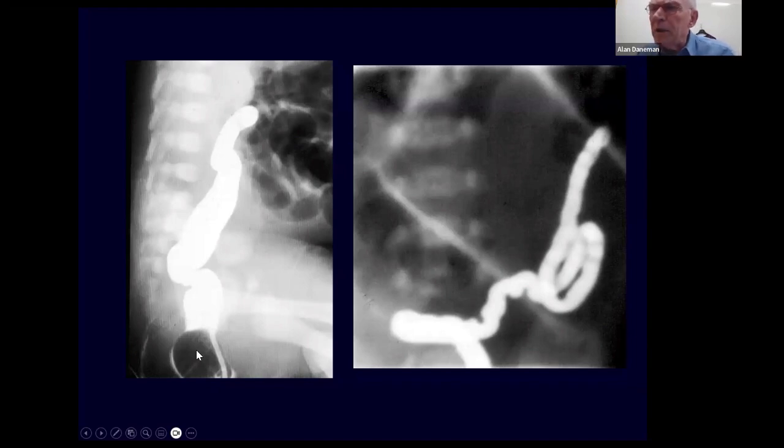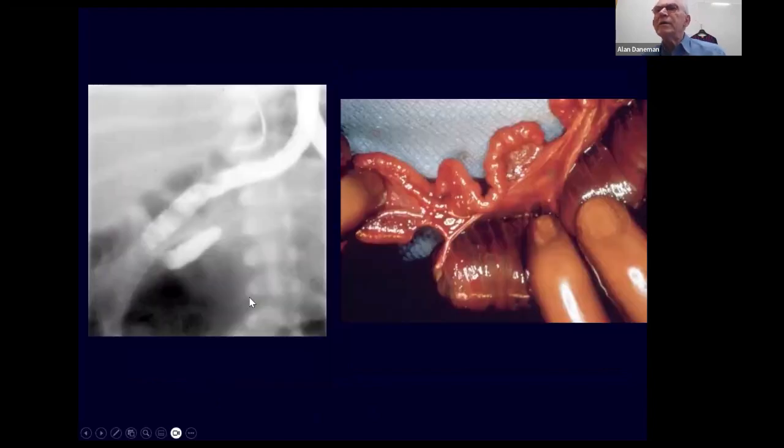Don't blow up balloons to this size in babies' rectums, because you can cause some damage, and you can actually perforate the rectum with a balloon this size. Either don't use a balloon at all, or just blow it up to a very small volume. Make use of taping the buttocks tightly and even squeezing the buttocks in order to keep the contrast inside, but don't rely on a balloon of this size.